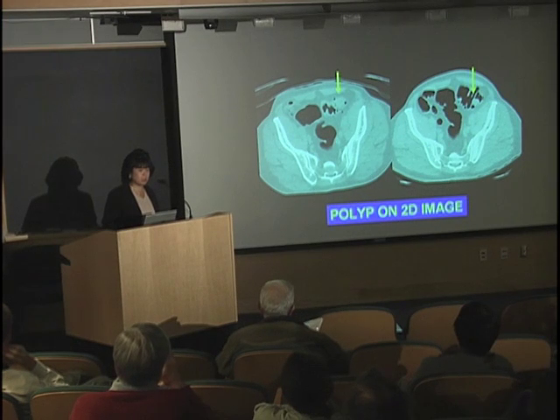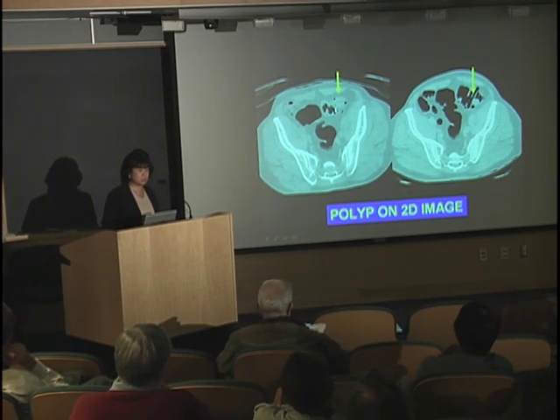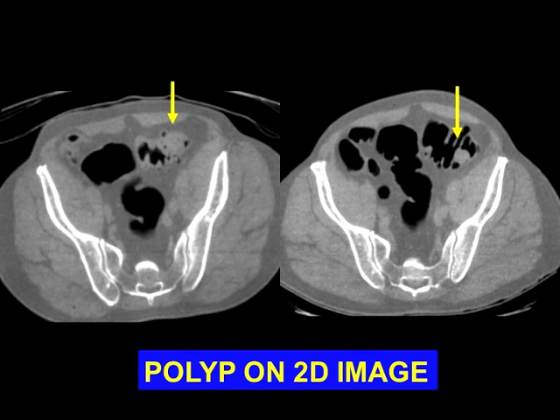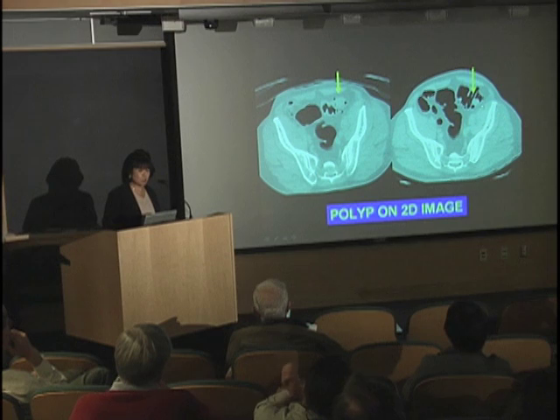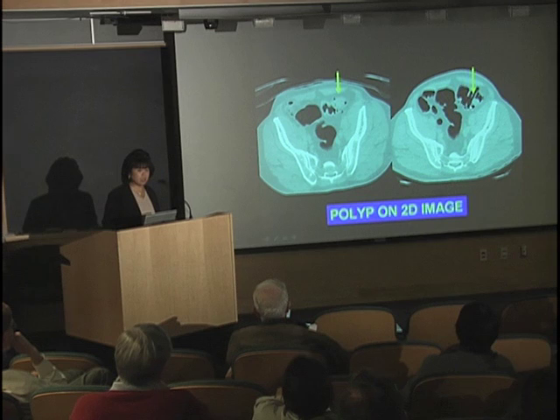So after you get off the CT scanner table, you're done with the exam and you can go home — we actually do all this fancy manipulation. This is just an example of a 2D image, with the patient in one position. You can see here where this is the sigmoid colon, where there's not very good distension. But with better distension and more insufflation from that carbon dioxide insufflator, we've nicely outlined this polyp.